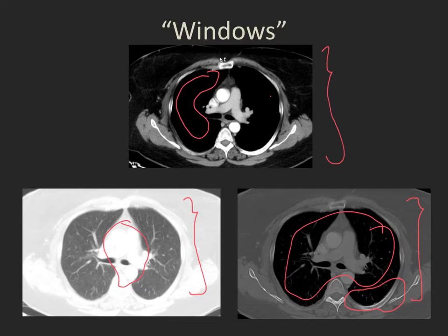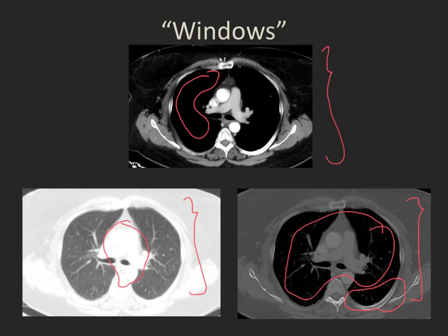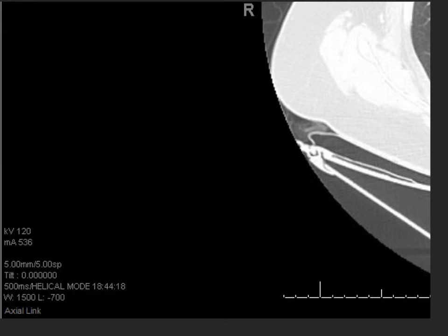This is why, for a thoracic or abdominal CT scan, the minimum we're going to use is these three different windows to look through the entire data set.